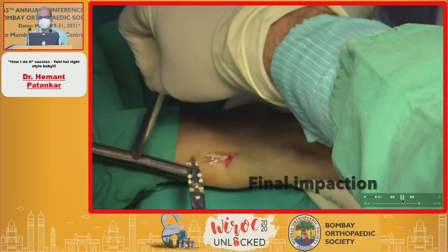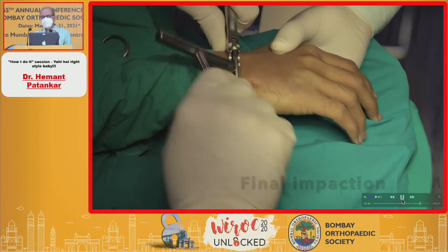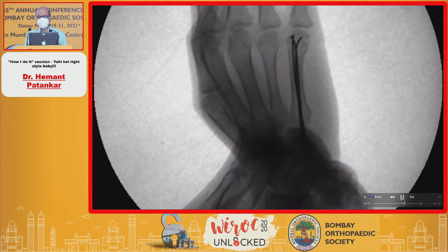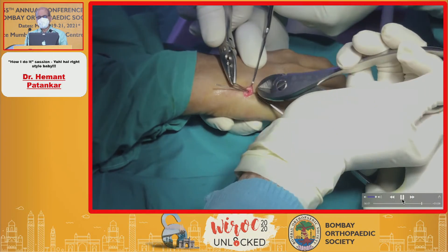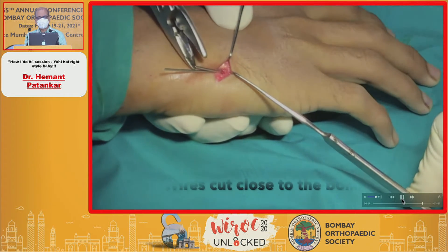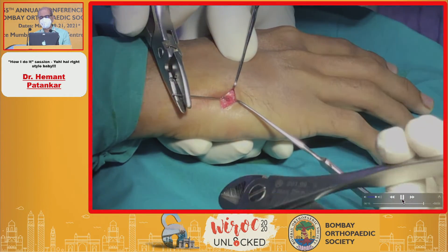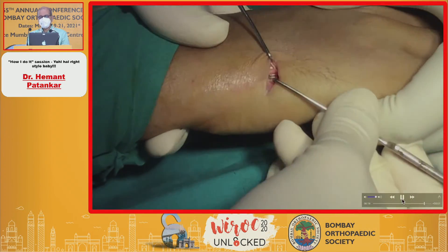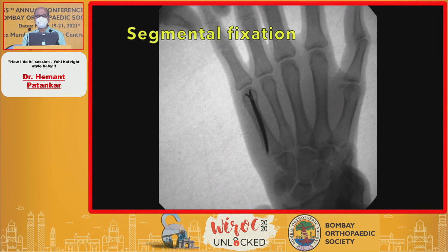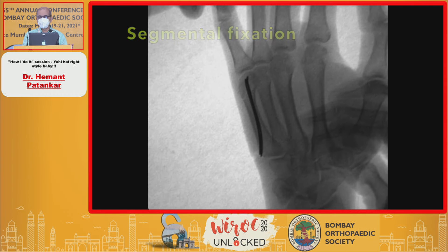Take a final impaction. That is impacted. The most important step now is to cut the wires flush with the bone — if you cut the wires flush, they will not cause any problems. If you are beginning to do this procedure, always start on the fifth metacarpal because there is no extensor tendon on the outer side and no nerve to damage if wires are cut longer. The wires are cut as close as possible to the bone. You can see the extensor carpi ulnaris on top — the wires are resting on the bone, not outside it. This is what we call segmental fixation; the problems of the segment remain to the segment with no involvement of the joint or tendons.